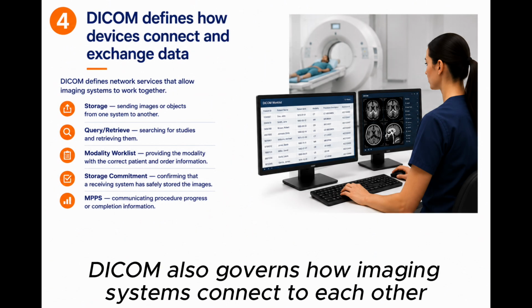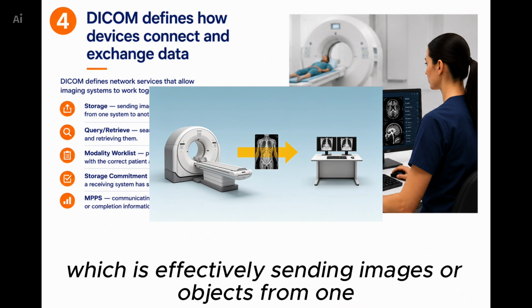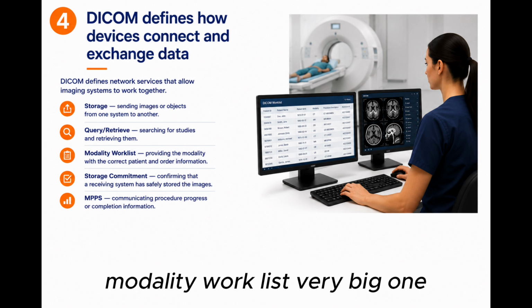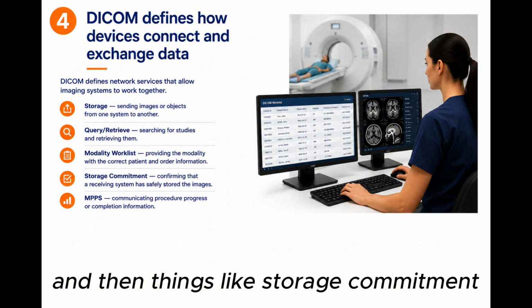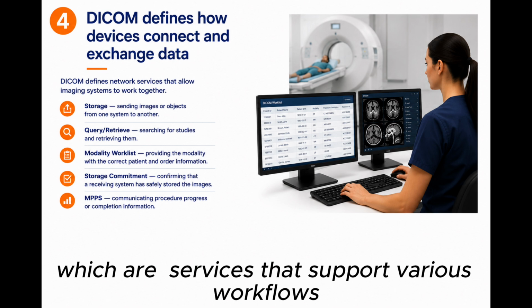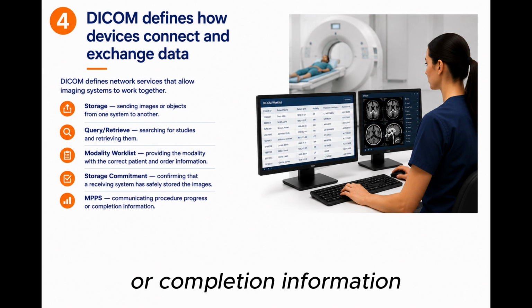DICOM also governs how imaging systems connect to each other over the network. It defines various services. For example, storage, which is effectively sending images or objects from one system to another. Query retrieve, as the name suggests, searching for studies and retrieving them. Modality worklist, a very big one, giving the modality the correct patient order information so that the technologists don't have to enter this manually. And then things like storage commitment or modality performed procedure steps, which are services that support various workflows. Things like confirming that the receiving system has safely stored the images or allowing the modality to communicate the procedure progress or completion information.